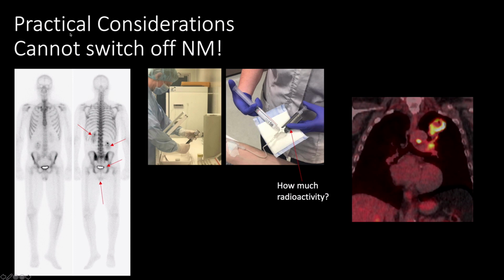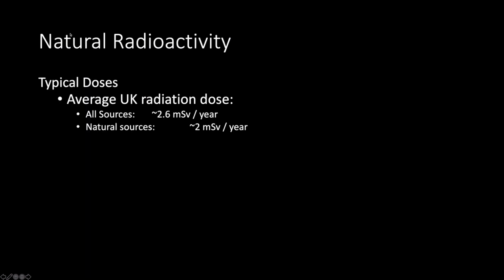So even if you've waited as long as 6 hours, the radioactivity would have dropped by a significant amount. Of course, we're talking about physical half-lives, not effective half-lives. There's also accounting for how long it takes the body to excrete it as well as the radioactivity. But this is really just to give an overview of the importance of knowing the half-life of the isotope that you are using if you are trying to do a particular imaging process.